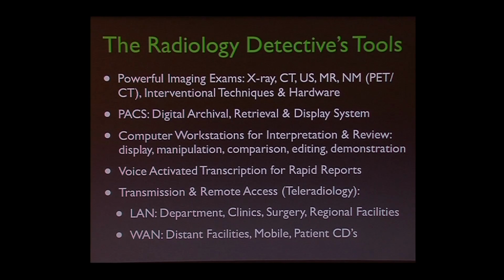Ultrasound, MR, nuclear medicine, PET CT, et cetera, are all tools in our bag of tricks. And then PACS is the name for the computer-based workstation and the whole process of manipulating, storing, archiving, and transmitting the data. It's called Picture Archiving Communication System, or PACS. And then, as I said, we have the computer workstations, and we even dictate now with voice recognition.